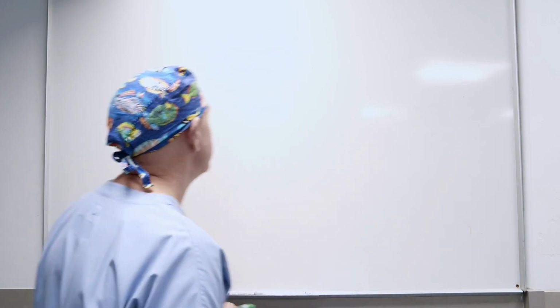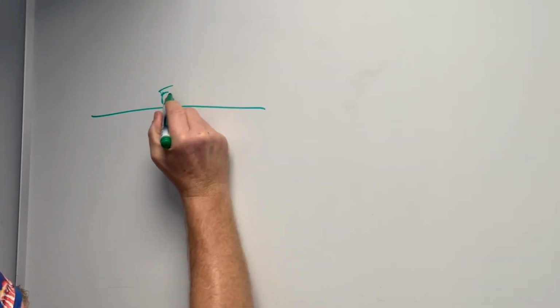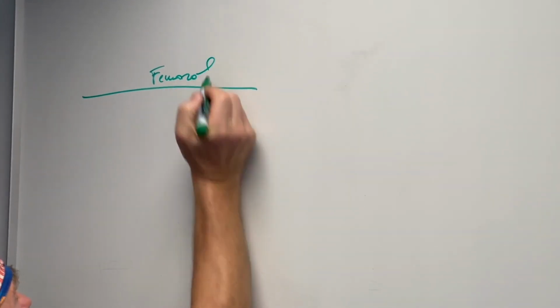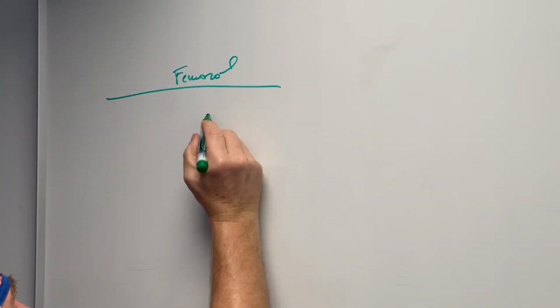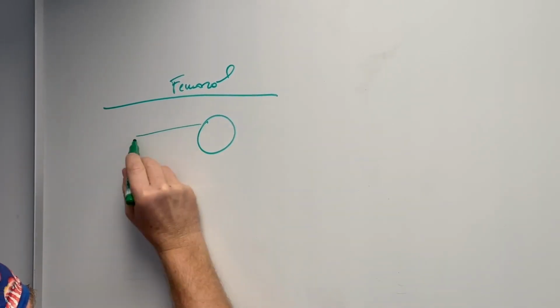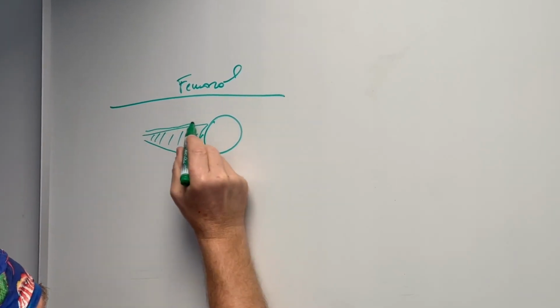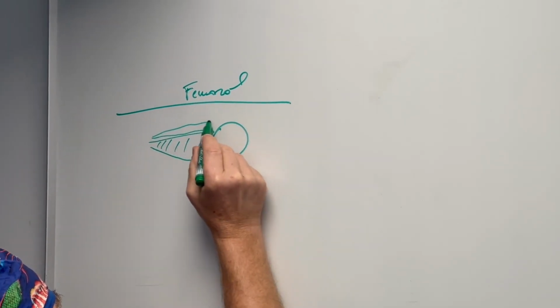Now, let's seamlessly transition to the primary blocks of the lower limb. We shall naturally commence with the femoral nerve block. The sonoanatomy landmarks comprehensively encompass the femoral region, including the skin layer, the artery, and you typically observe the nerve in this manner, which may possess two smaller components alongside the genitofemoral nerve, the artery, and its accompanying vein.